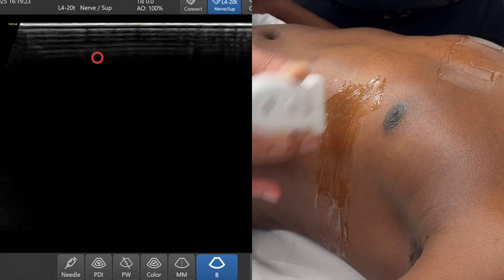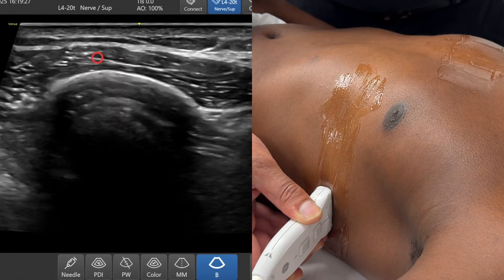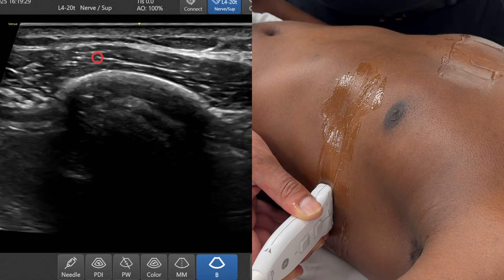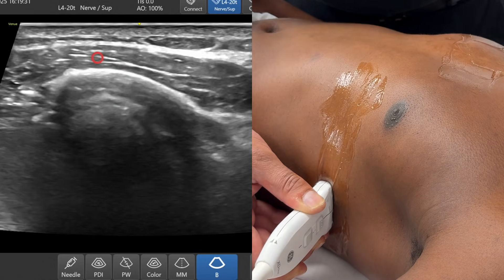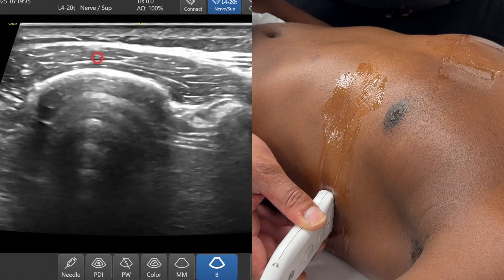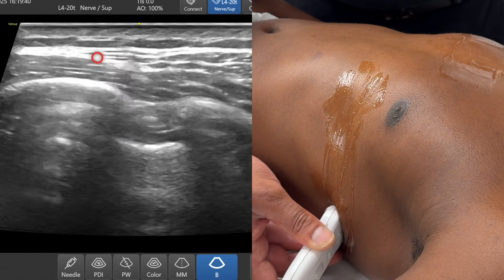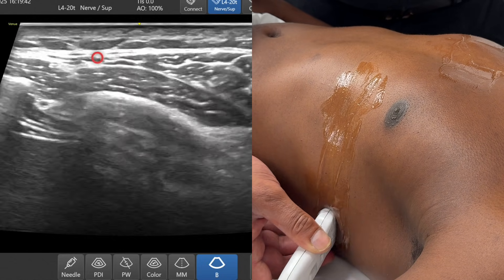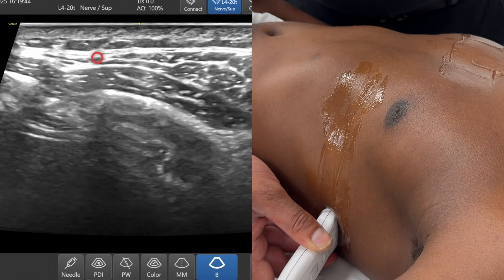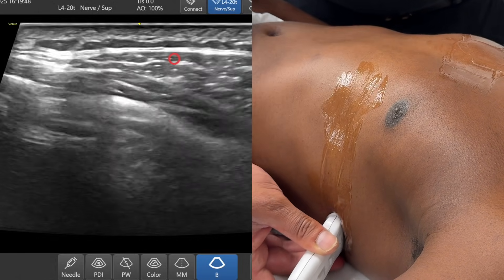As I slide the probe posteriorly, you'll start to appreciate I'm now coming across multiple ribs. I'm just going to increase the gain a little bit to make it more obvious. My marker is lying over serratus anterior. As I slide up and down, notice something else is sneaking into view — latissimus dorsi is appearing over here.